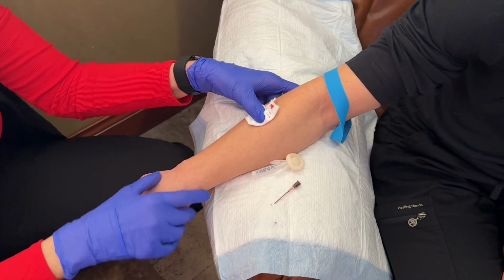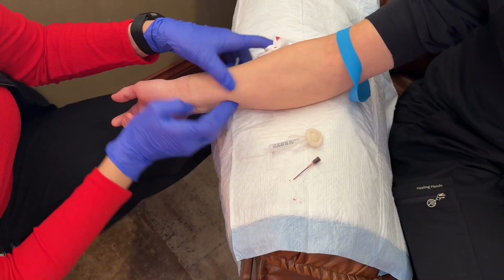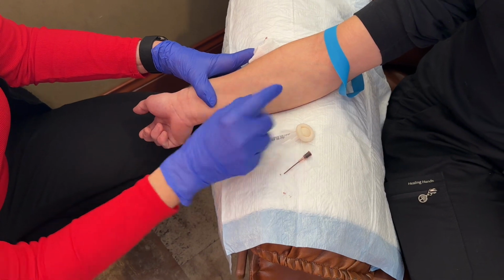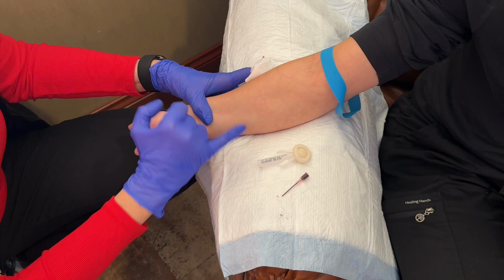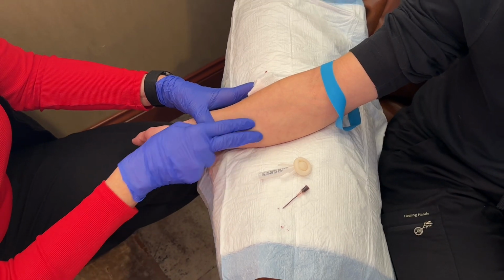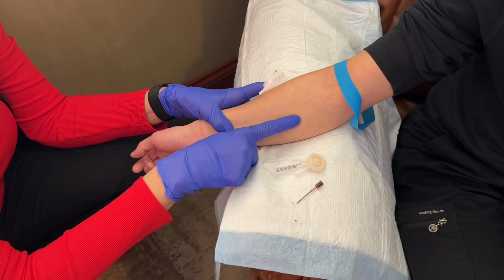Bifurcations in veins. If you have two veins coming together, like if you have a vein coming this way and a vein coming this way and they both meet up, like Steph's got a nice vein here. This would have been a beauty too. But if you had one coming up diagonal and another one coming here, and then all of a sudden you can see this much, I can feel this much of this vein. If you can feel a vein, they're good to go. Bifurcations in veins, right there at the Y, right below it, is a fantastic place because those two are meeting to come together. You know that vein's got girth to it. So look for bifurcations in veins too and go straight into it.